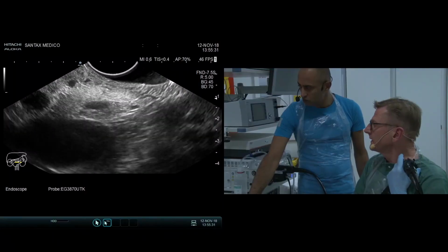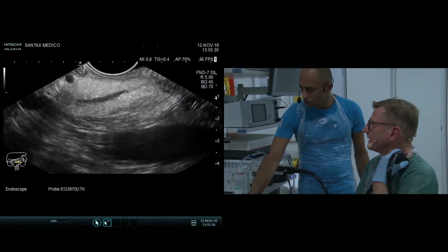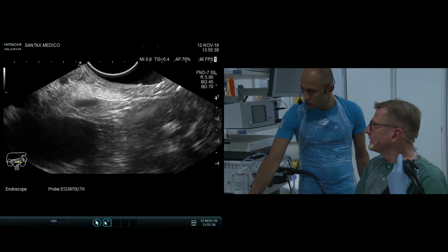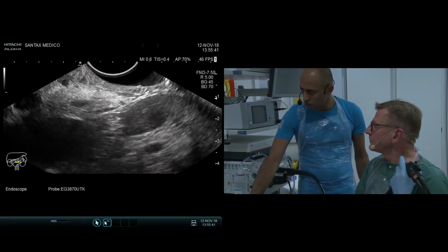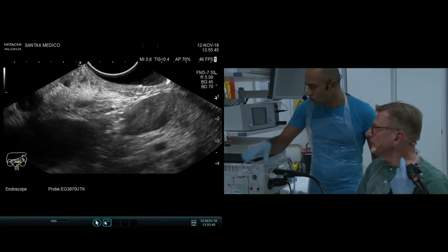Peter, I think this is a divisum. You see that the pancreatic duct, this is the common bile duct, this one, and underneath you see a very small, in the head, another duct, and this is the Santorini. It goes to the minor papilla, I think. Oh, this one? This is the small one, yes, this is the head part. This is the head, so yes.